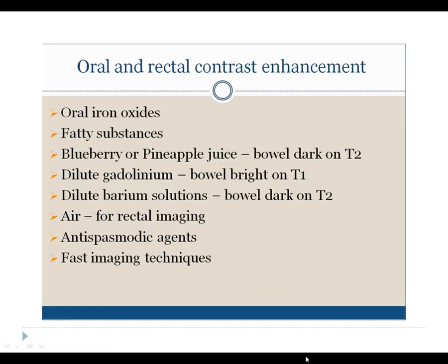Oral and rectal contrast agents aren't used very often in MRI. In facilities that do choose to use them, there are several different contrasts available to enhance the bowel. Oral iron oxides and fatty substances can be used to highlight the bowel. Some facilities use blueberry or pineapple juice to create a negative contrast in the gastrointestinal tract to allow other structures to be visualized. Dilute gadolinium and dilute barium solutions can also be used.